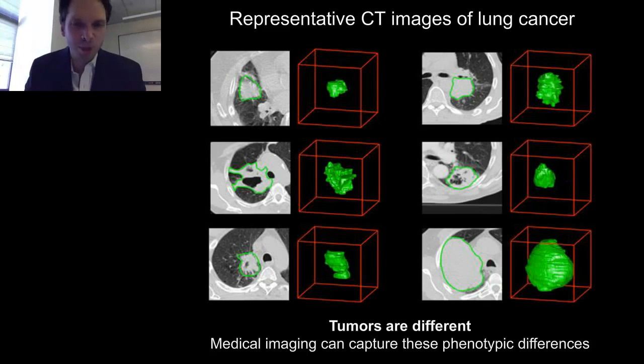Remember that in the clinic, for diagnosis and response assessment, only a maximum diameter is used. They draw a line here and say, this tumor is 5 centimeters, and another tumor is like 8 centimeters, discarding all other information. Based on that, there will be different diagnosis and staging, but also response assessment. So there's much more phenotypic information already present in these imaging data that we can extract. One of our main aims is to apply computational approaches to this imaging data and try to extract that phenotype.